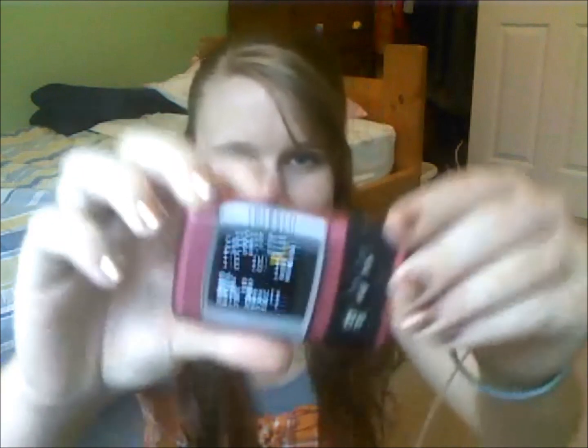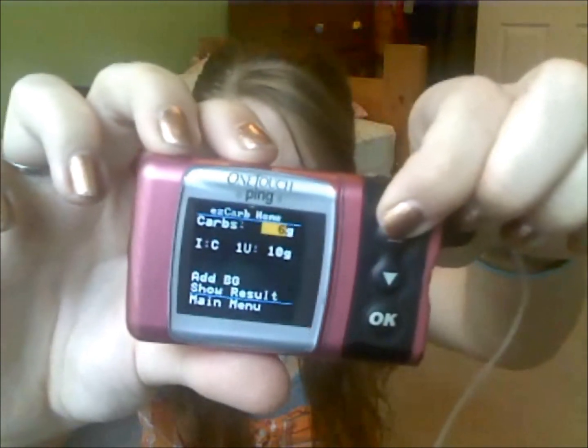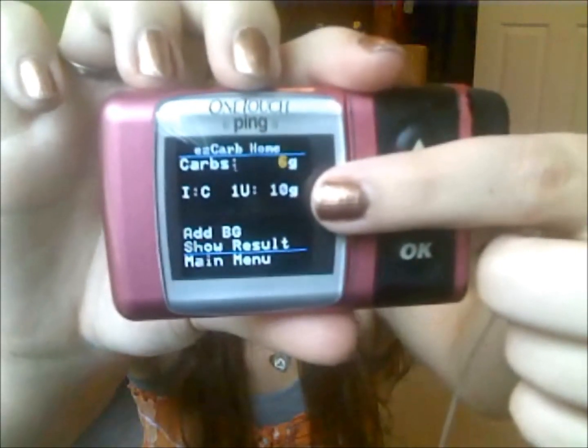Second on the list is easy carb. Super cheesy, but this is basically if your insulin to carb ratio is like 1 to 7 or 1 to 12 or something a little bit more complicated than 1 to 10 to figure out, then you can go ahead and actually put in how many carbs you're having. So let's say I'm having 5, which isn't a lot, that's actually 6. Then it can go ahead and calculate how much insulin you should give based on your insulin to carb ratio. As you can see right here, my insulin to carb ratio is 1 to 10, and so it'll just calculate that for you.